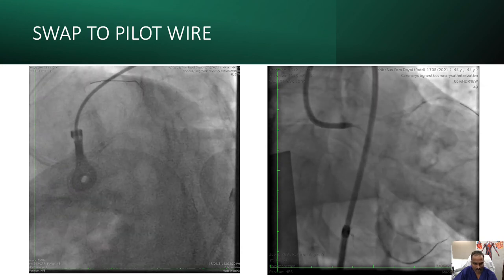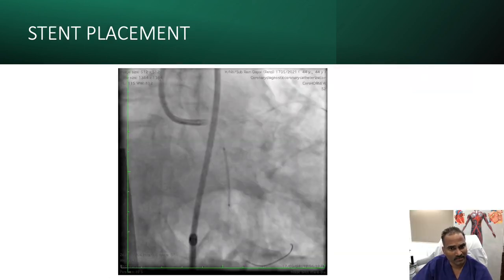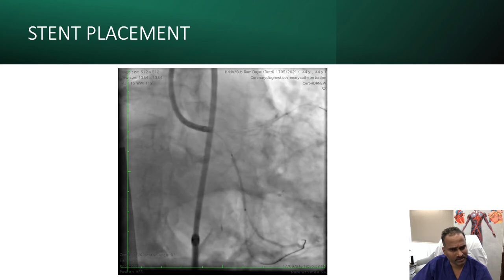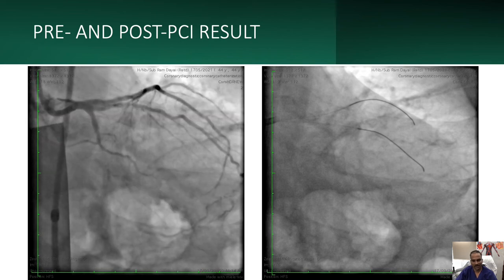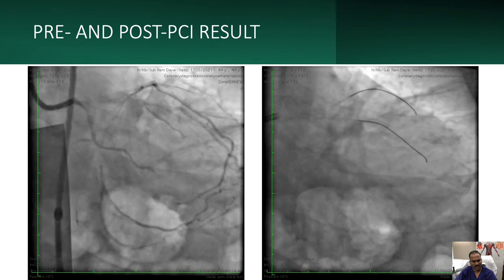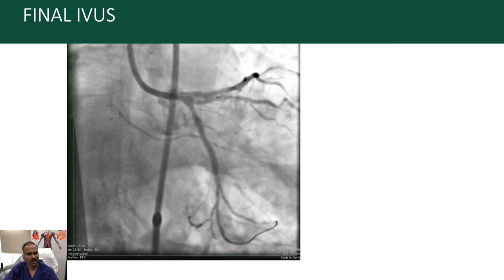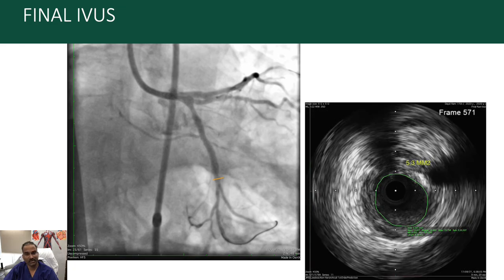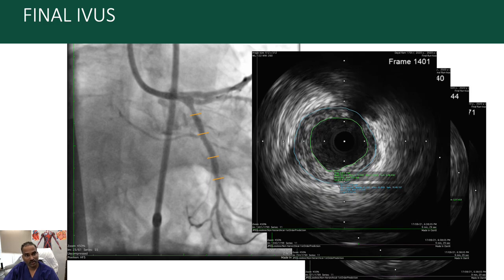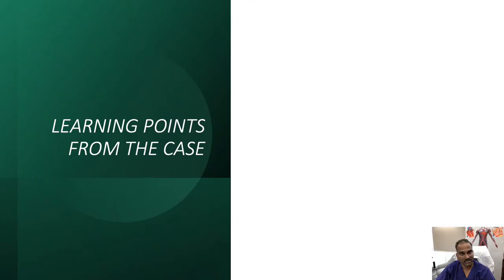Once true lumen position was confirmed, we pre-dilated and placed a stent using IVUS guidance for both sizing and length selection. The stent used was a 2.75 x 20 mm stent. The post-angioplasty result is quite good. On post-IVUS, the distal reference area is 5.3 mm², the MLA is 5.3 mm², the proximal lumen area is 6.1 mm², and the proximal reference shows approximately 50% plaque burden with a lumen area of 5.6 mm². By IVUS the result is quite good, so we left it at this stage.